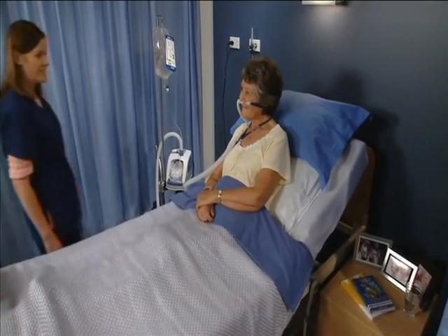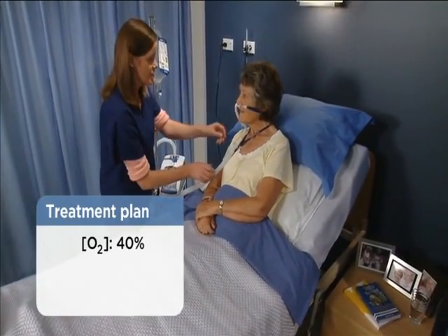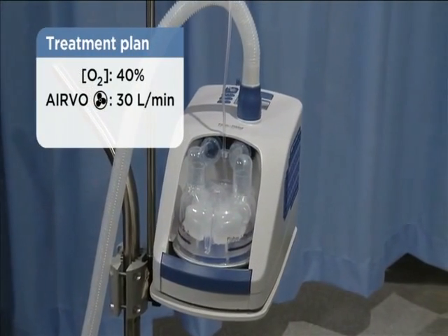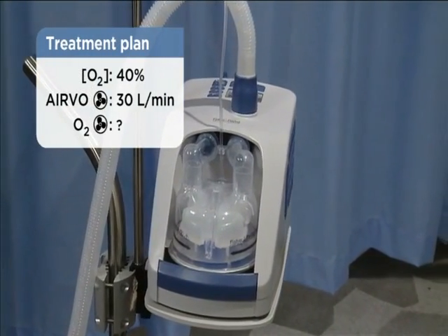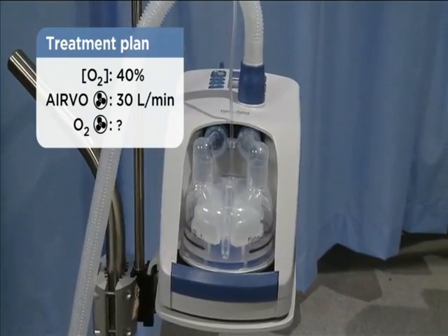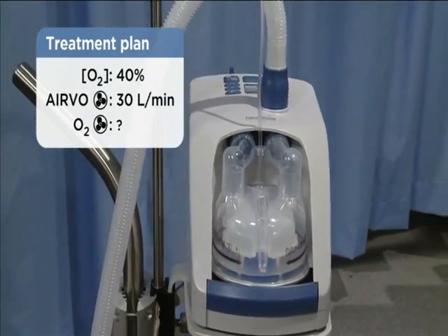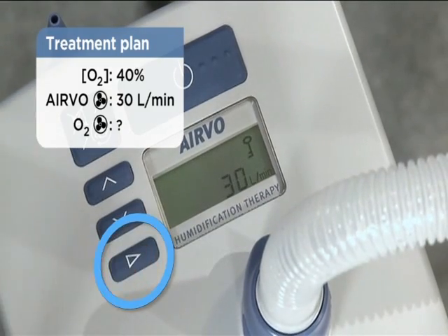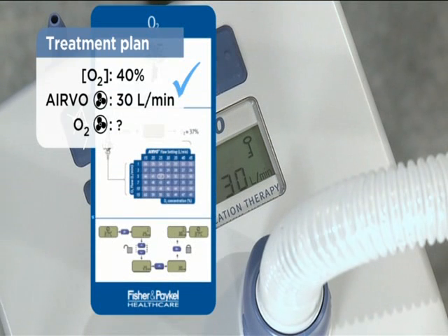This patient requires an oxygen concentration of 40% and an AIRVO flow rate of 30 litres per minute. We can determine the wall oxygen flow rate she will need by using the oxygen chart. First, check the AIRVO flow setting by pressing the Mode button. In this case, it is correct. If not correct, refer to the swing tag to change it.